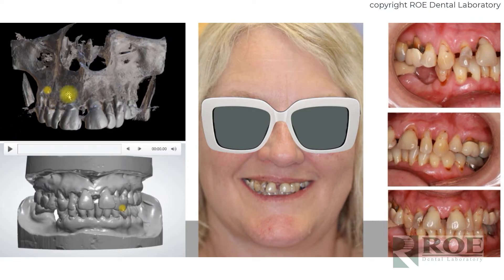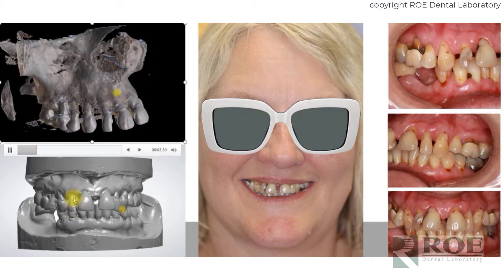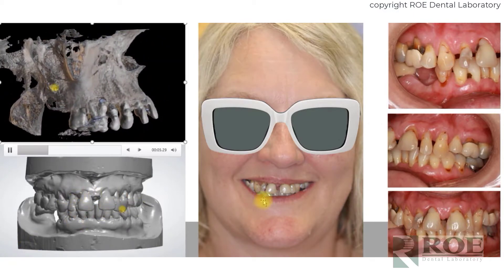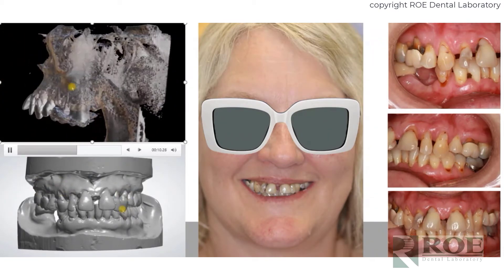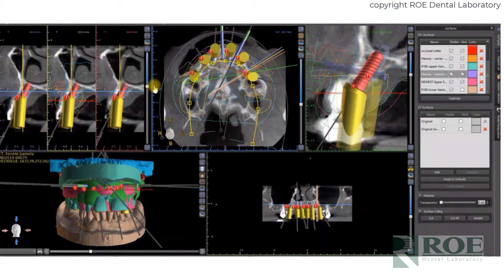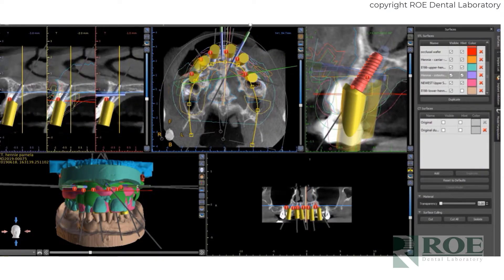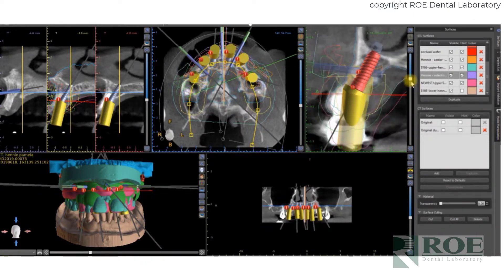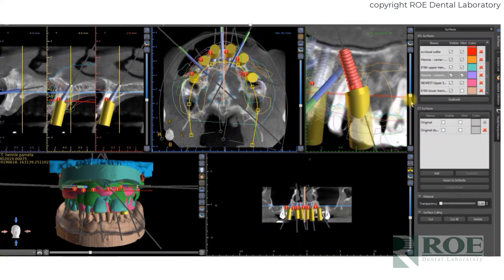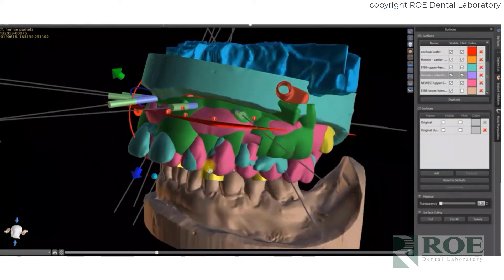Let's go through a case quickly. This is the cone beam, the digital analog impressions, and the required photographs. Once we have all these records, we digitize them, bring them into our software, and prepare the case so that the bone reduction, implant placement, new setup, and smile design are all in the plan. We can then spend 15 to 30 minutes reviewing and approving the plan and preparing the case for you.